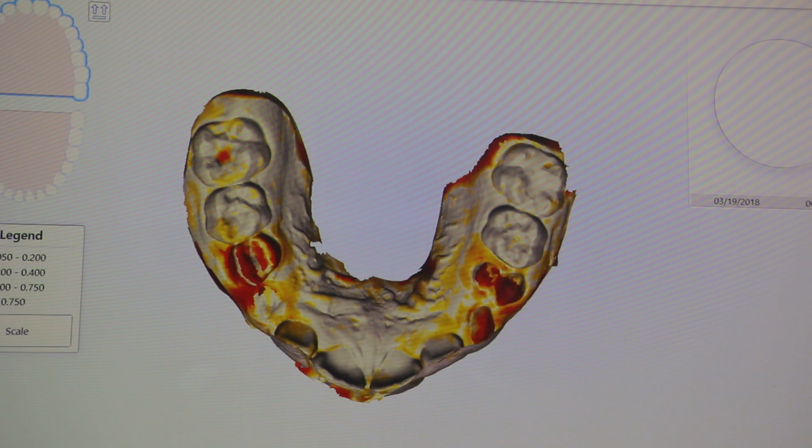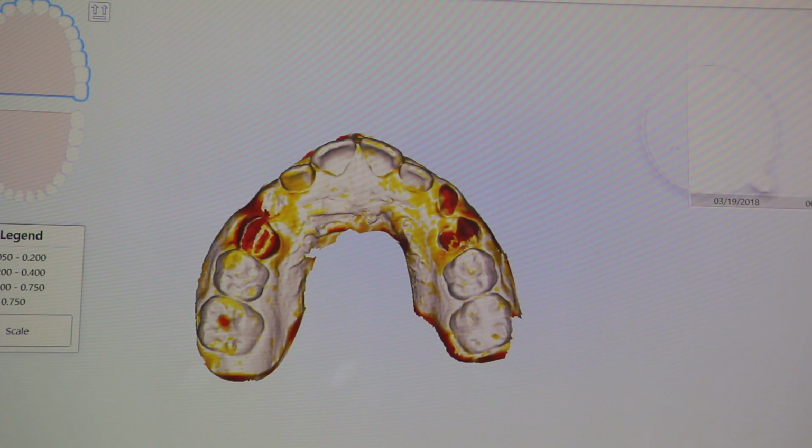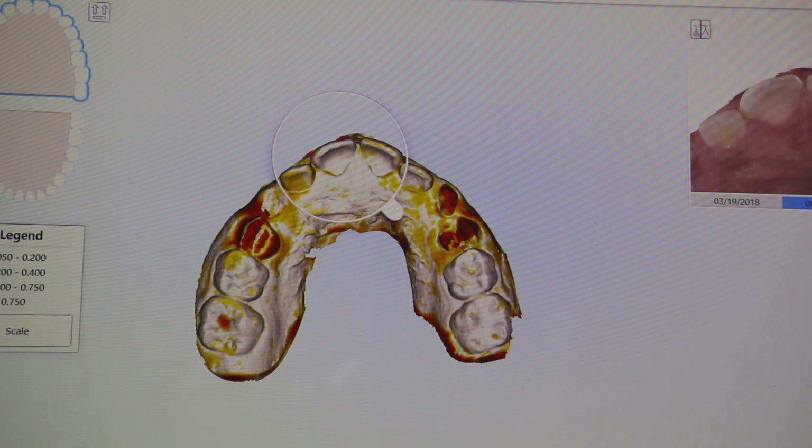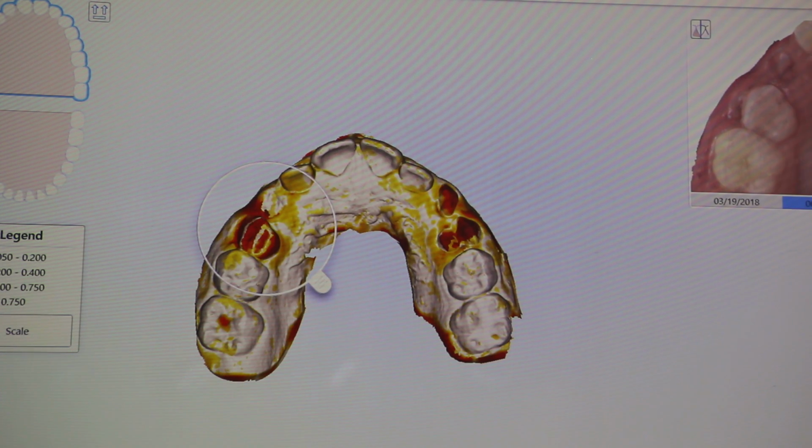But if you were treating a case that had some lower crowding, and the patient said, I don't see my teeth moving, but all of a sudden you do this time lapse and their teeth go like this, and right away they go, oh wow, I didn't realize my teeth have really moved a lot. It's just kind of a cool thing to do. Sometimes it's just because of where they're at in the stage of treatment. You might be broadening things out before you tip out the lowers. Exactly, because of the staging of the sequences of the planned movements.